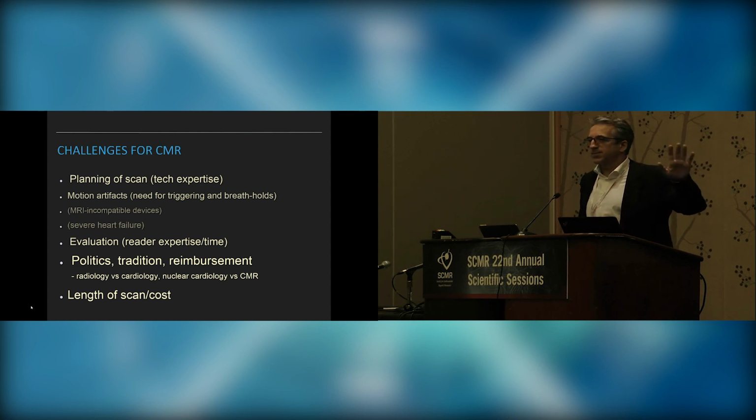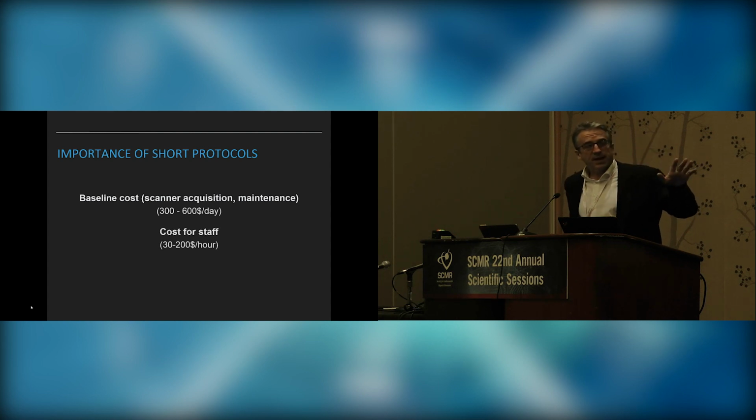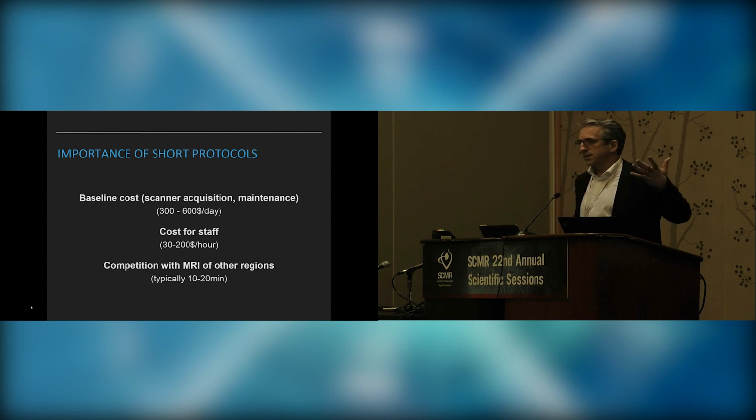While we'll certainly not address the politics, I'm happy to invite everybody to discuss that with me one-on-one. The length of the scan and the costs are important. Excuse me if these numbers are not correct for your site, it's just a ballpark. If you take the baseline cost of a scanner and add the cost for the staff, then there are costs associated with the technology, so every minute counts that you can spare. And of course, in a scanner that is busy with knees and heads that may take 15 minutes, it doesn't make a lot of economical sense to do a cardiac MR for 45 minutes. So that is why it's important.